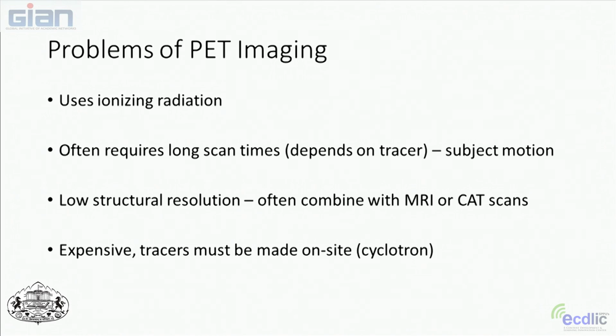So one problem that we have is that people sometimes can't lie still for that long, especially certain clinical populations. And what they used to do at the PET center is they would take a piece of soft plastic, and they would mold it to the person's face. And then they would put this on top of the person's face while they were getting the PET scan to try to hold them in place so they couldn't move while they were collecting this data.